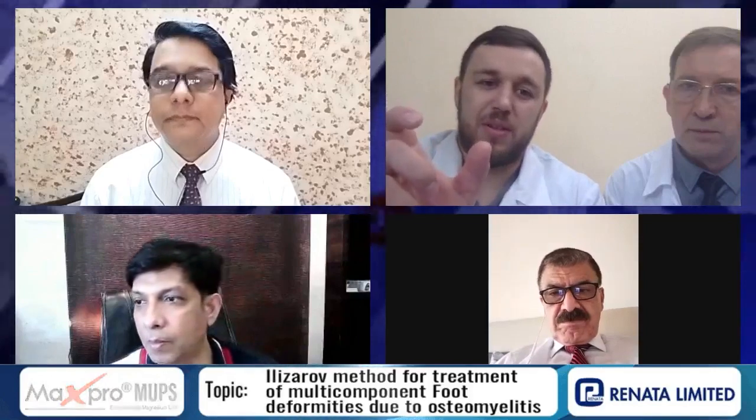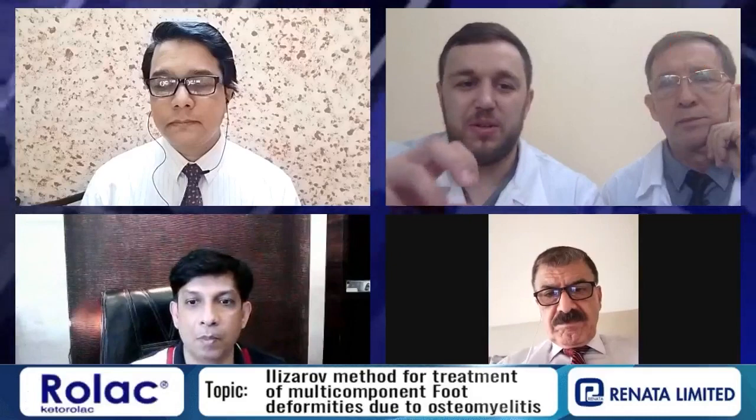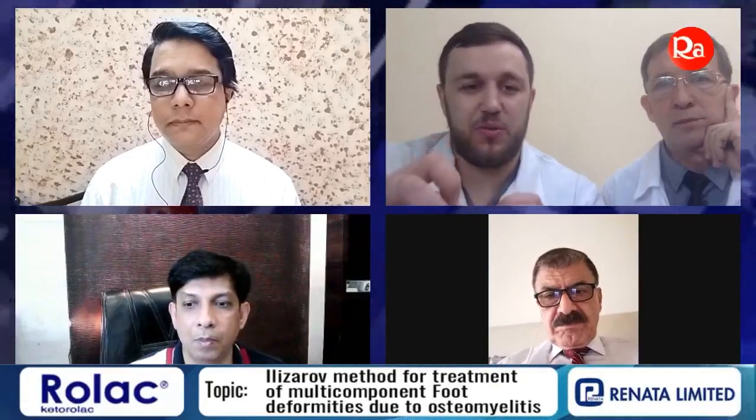Oh, it's a difficult question because, for example, now I have a patient with a soft tissue defect on the plantar surface, 20 centimeters by 10 centimeters, so a big wound. And for that, we create some deformities of the foot, and after that, gradually correct it.